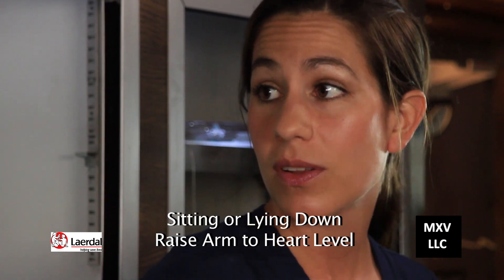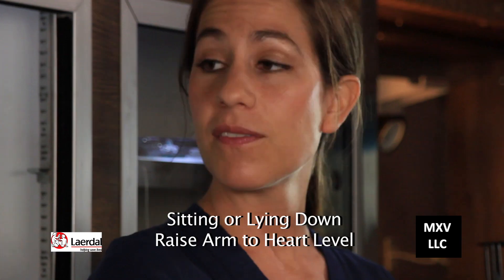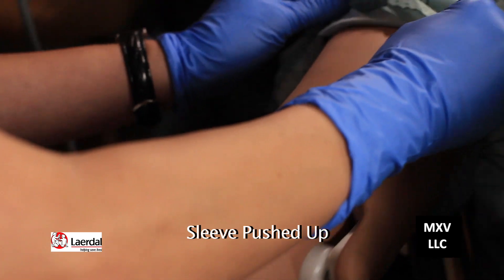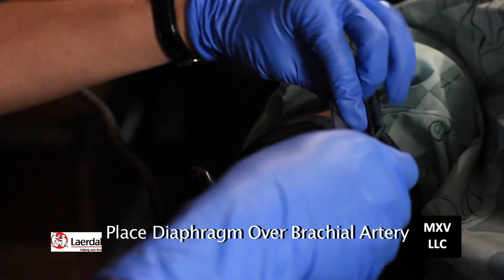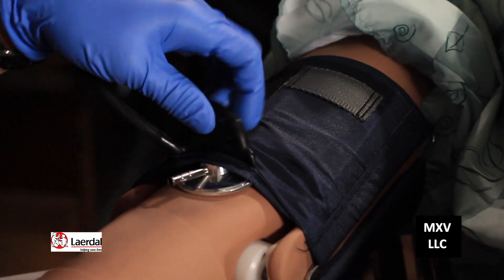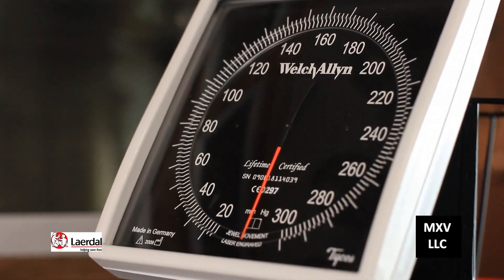The person should be sitting or lying comfortably, and once the cuff is secured, the arm should be raised to the person's heart level. The sleeve should be pushed up and place the diaphragm of the stethoscope under the cuff over the brachial artery. The gauge should be placed so it is easily read.